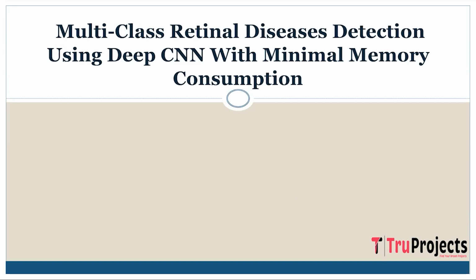Welcome to True Projects. In this video, we are going to explain about the project, which is multi-class retinal diseases detection using deep CNN with minimal memory consumption.